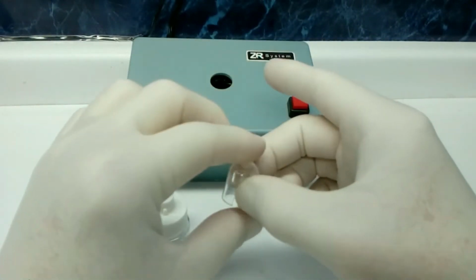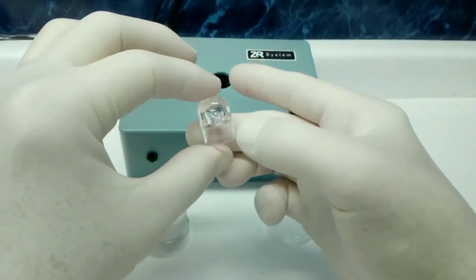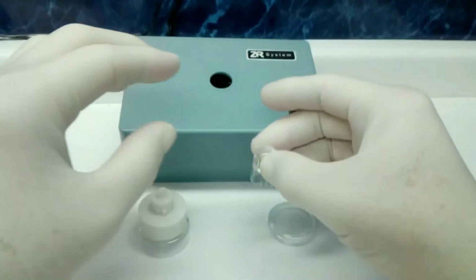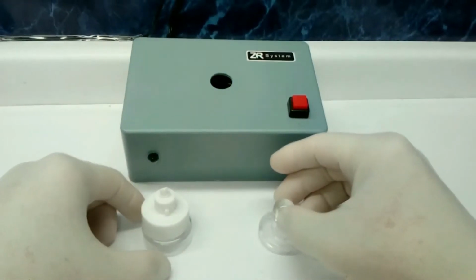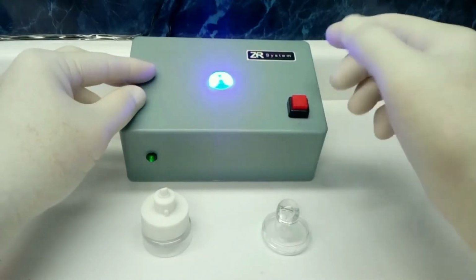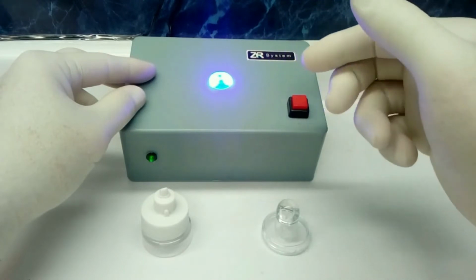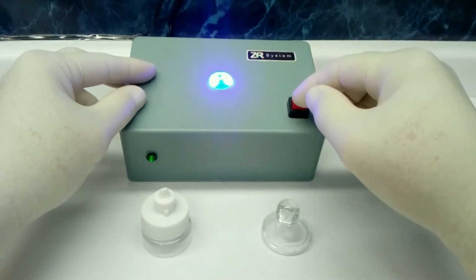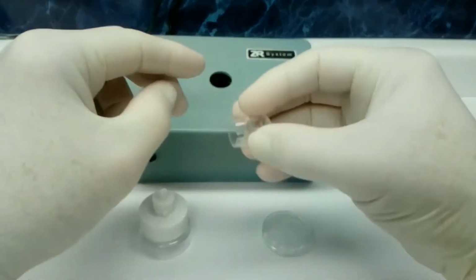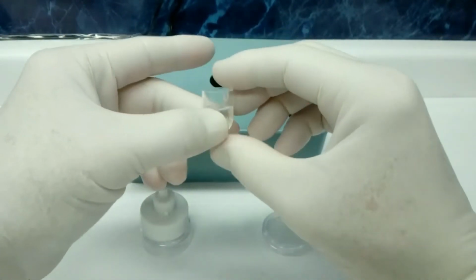Now I will show you the negative mold or polymerization photocapsule. It is an attachment made of transparent silicone, included in a glass capsule. Inside the mold, a negative is formed that will give the anatomical shape to the crown. Finally, I will show you this device or polymerization chamber, whose function is to solidify the resin of the aesthetic color that you want to process using a high-intensity internal light system.